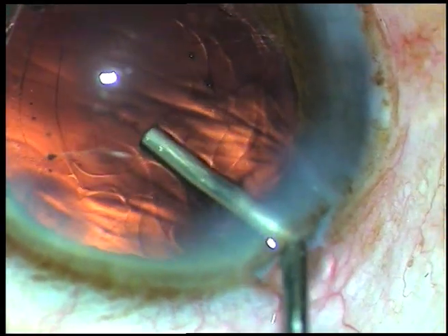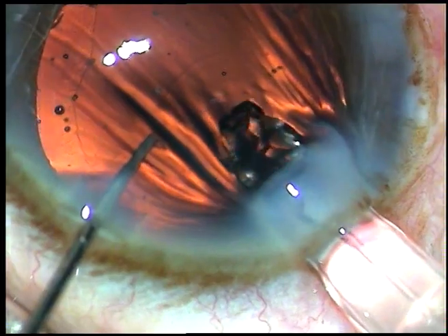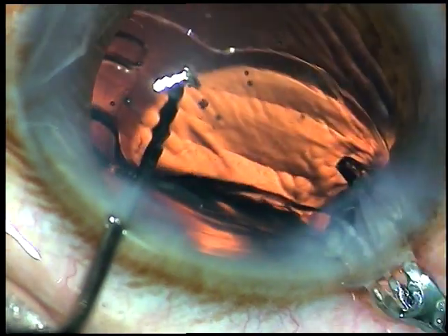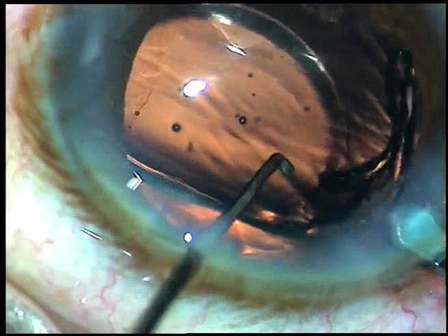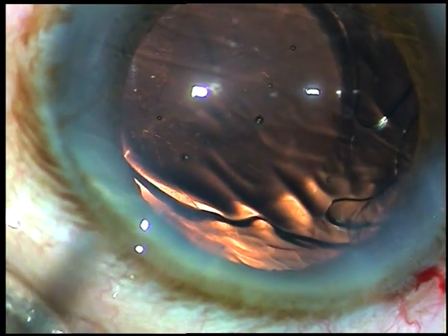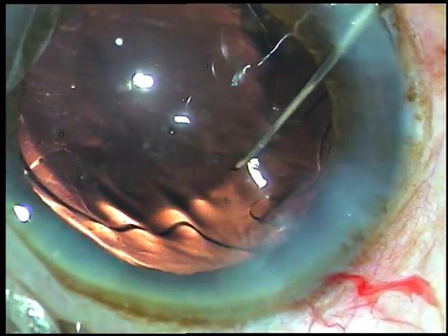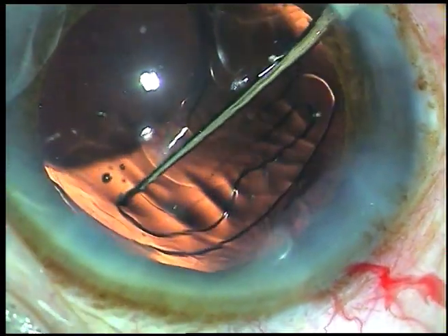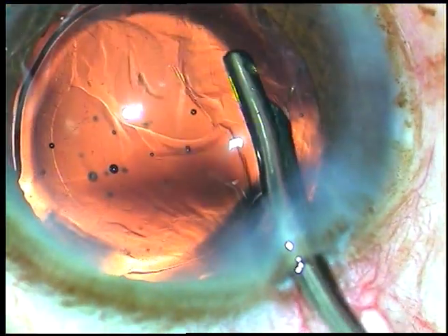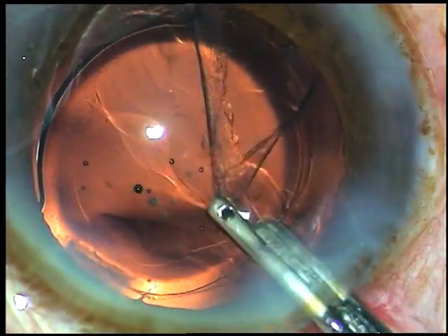Cortical clean-up is still to be done at 6 o'clock, but before that I want to implant the intraocular lens in the capsular bag. I inflated the bag with viscoelastic and here it is. The trailing haptic is being implanted in the bag using the Sinskey hook. Now you can see the rhexis margin.